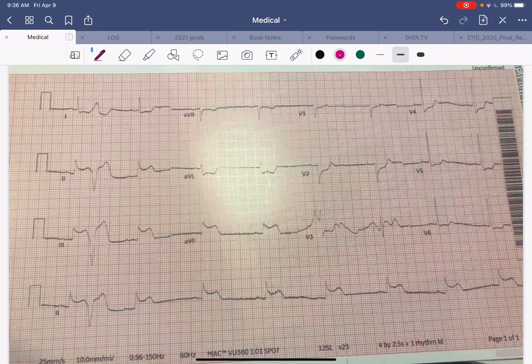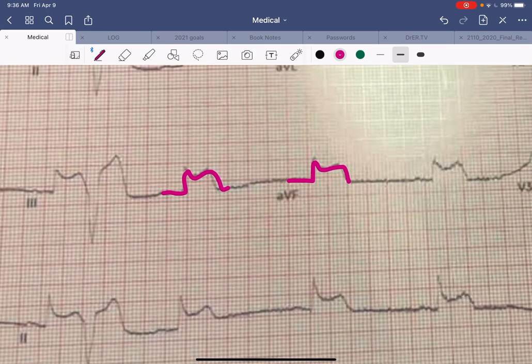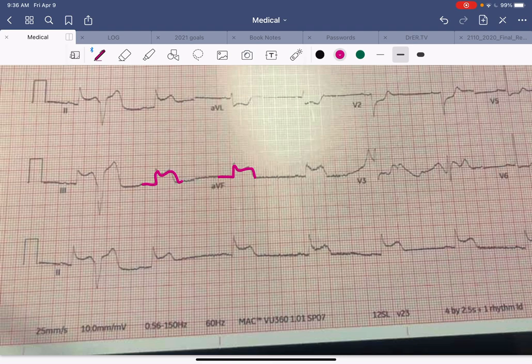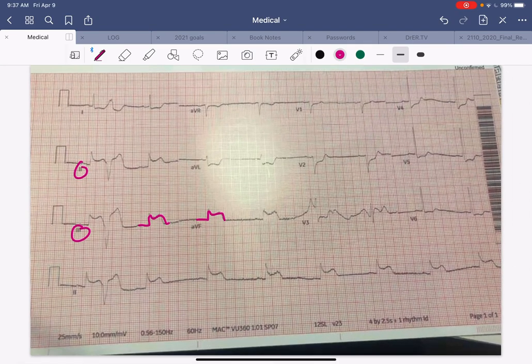A very different EKG — you would guess this is a whole different patient. It's still sinus but a little bit slower than before. You can see what we call tombstones — squared-off QRS complexes — and you can see those in the inferior leads: two, three, AVF. There are inferior ST segment elevations in all three lower leads.